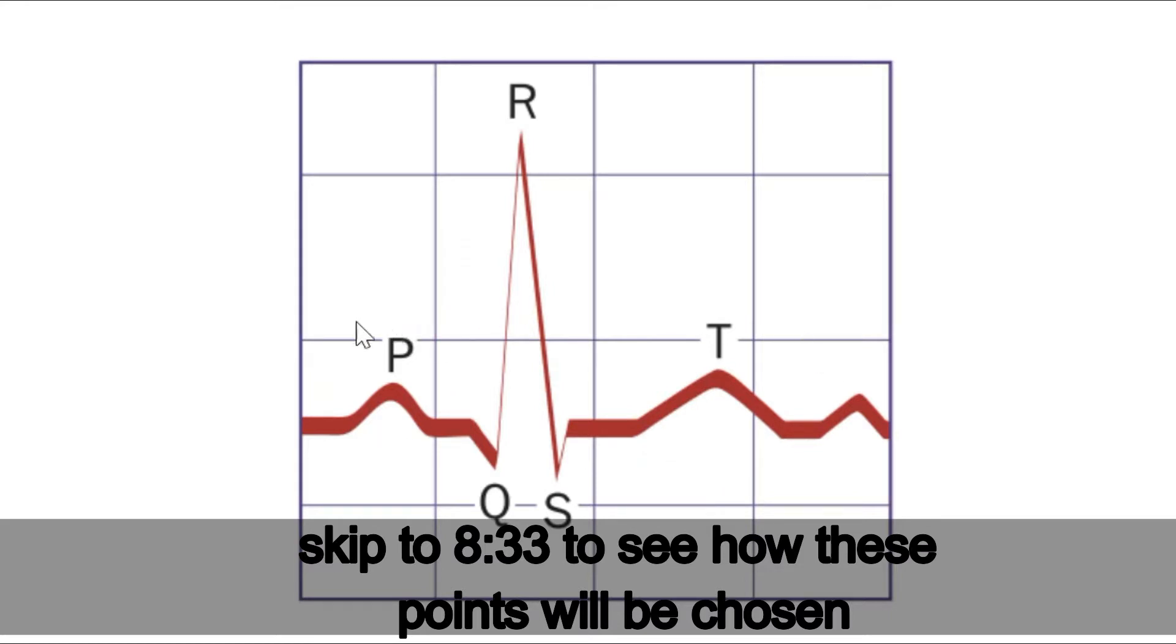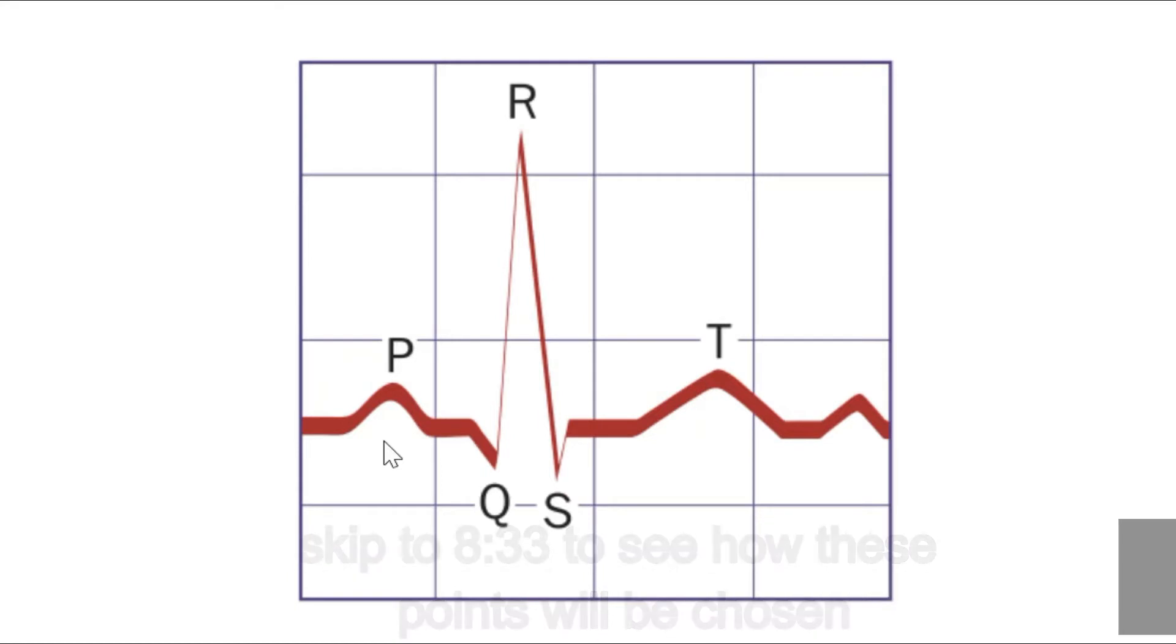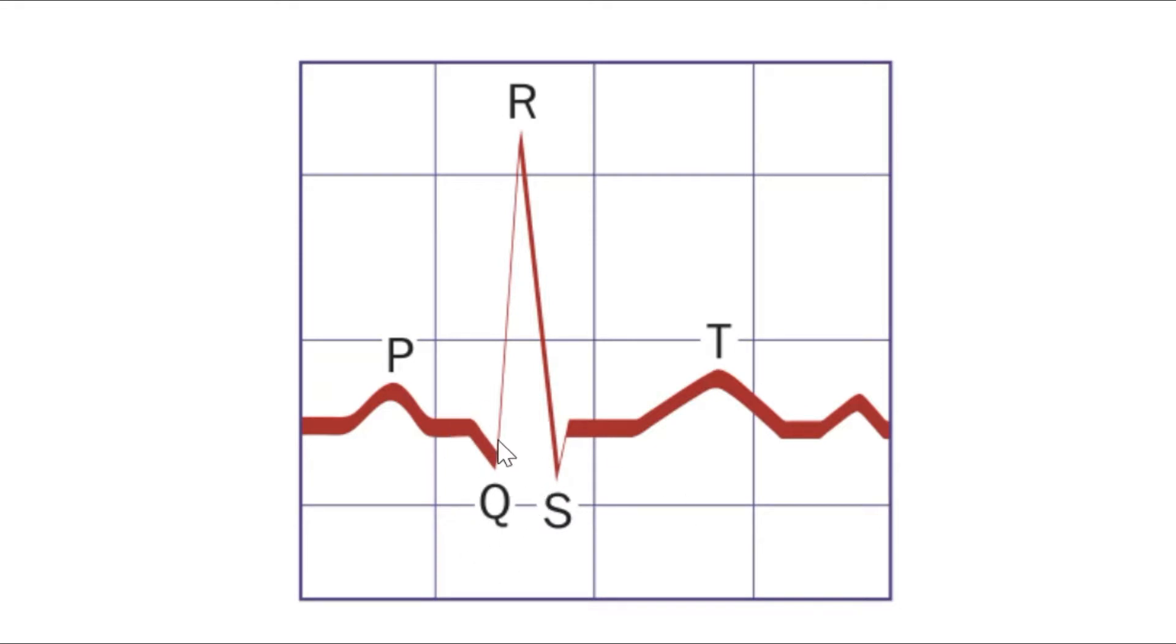Once we code it, it will become more clear how we will use spline. QRS are very sharp features which are best represented in the interp function using pchip. Once we get to the interpolating of these points, we will be using the particular functions for them.